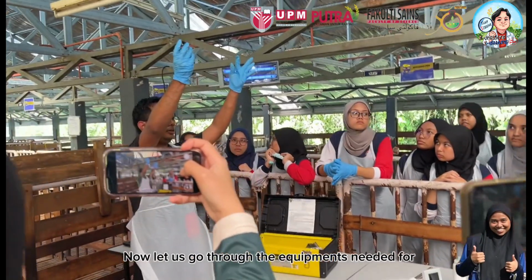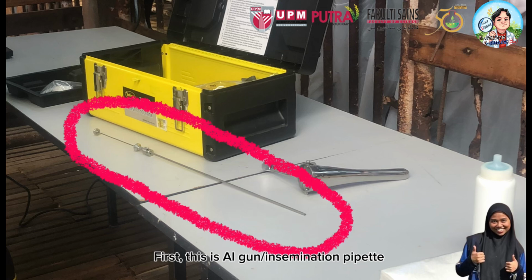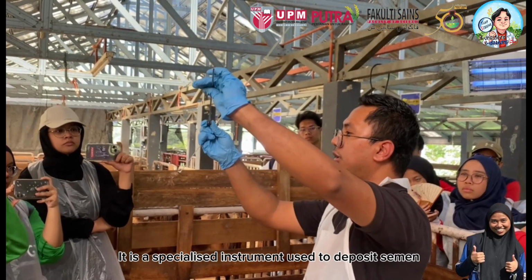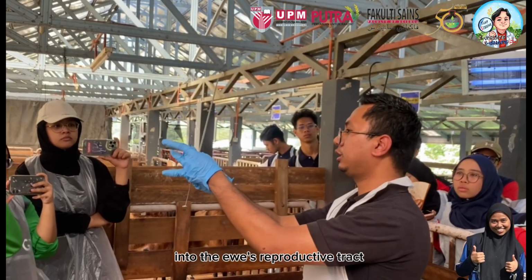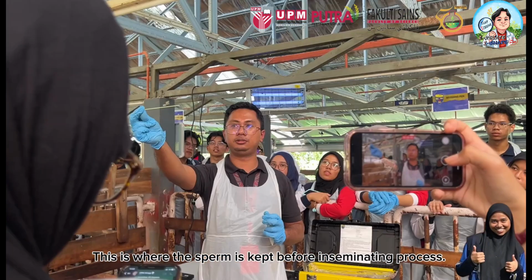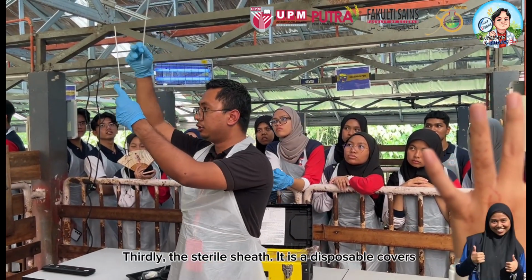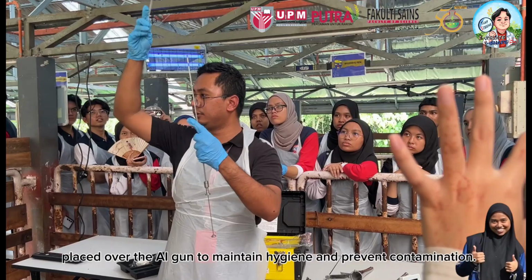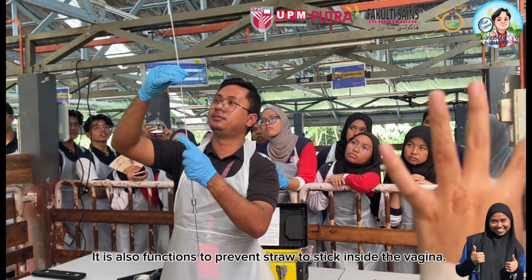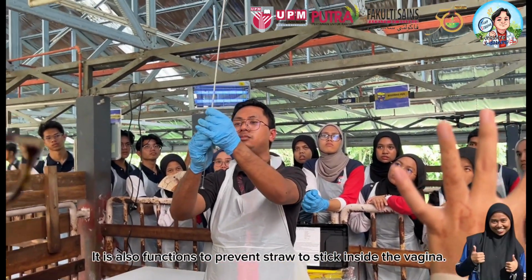Now let us go through the equipment needed for the insemination process. First, this is the AI gun or insemination pipette. It is a specialized instrument used to deposit the semen into the female reproductive tract. Secondly, the straw. This is where the sperm is kept before the inseminating process. Thirdly, the sterile sheath. It is a disposable cover which is placed over the AI gun to maintain hygiene and prevent contamination. It also functions to prevent the straw from sticking inside the vagina.